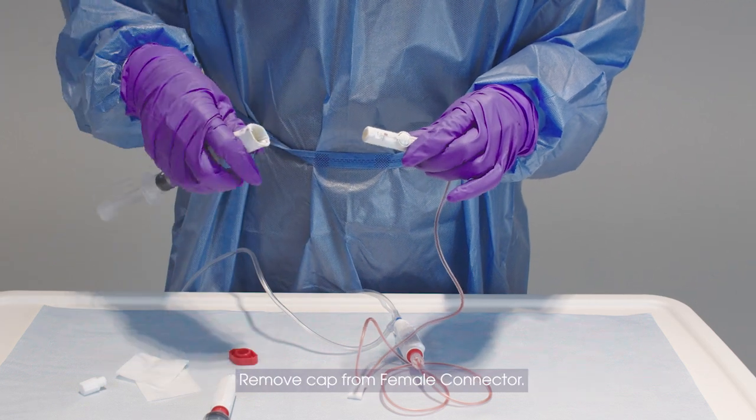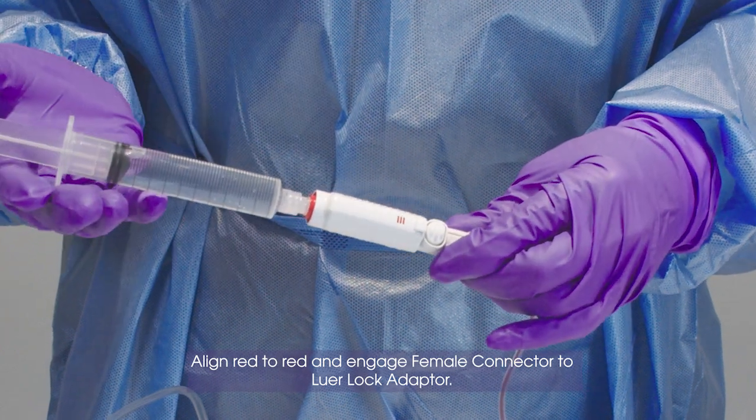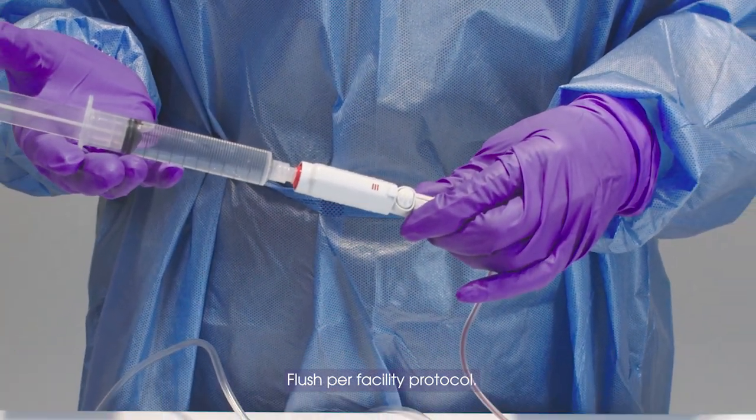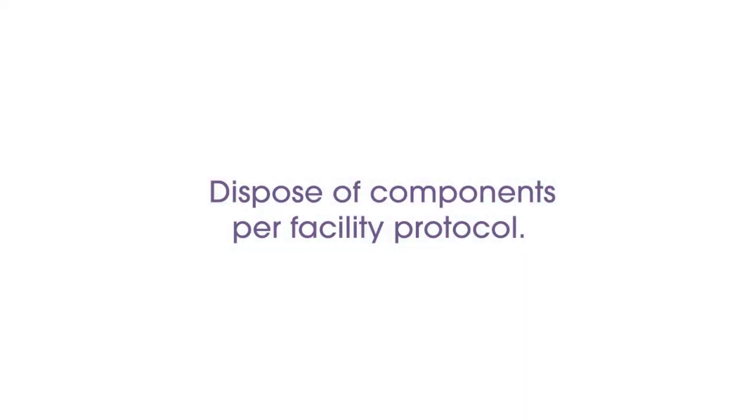Remove cap from female connector. Align red to red and engage female connector to lure lock adapter. Flush per facility protocol. Dispose of components per facility protocol.